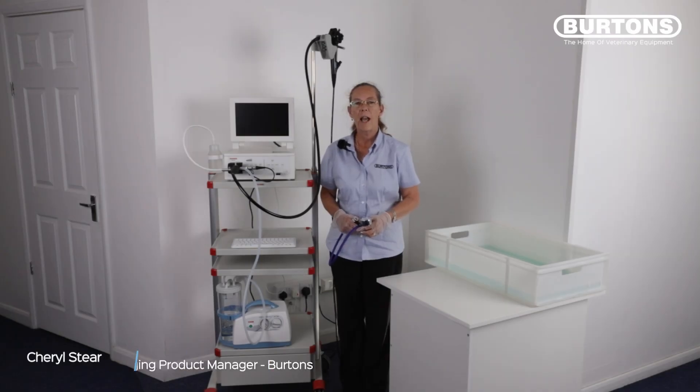The following video demonstrates how to clean and disinfect your gastroscope using your suction unit.